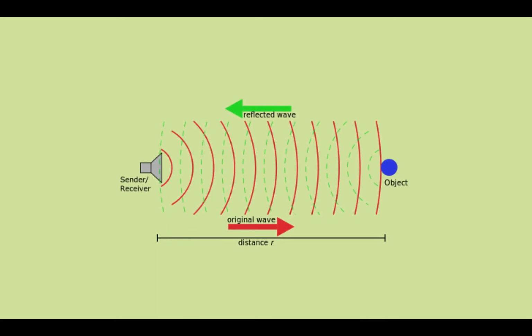The probe sends ultrasonic waves of greater than 20,000 Hz, which is a higher frequency than what can be detected by human ears. These waves travel until they encounter an object, such as human tissues, blood cells, or bones, at which point the wave is reflected and then received again by the probe.